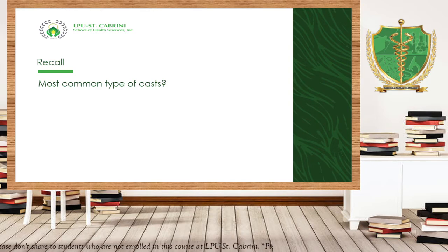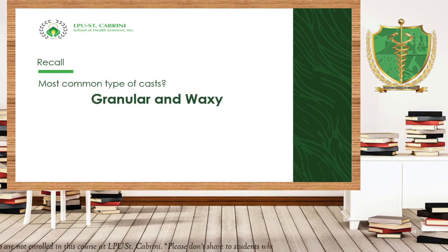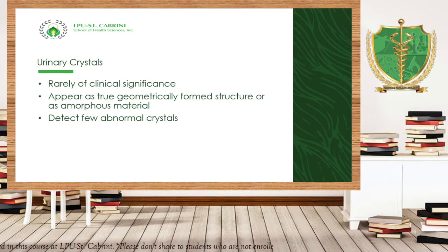Next question, most common type of cast. The answer for this one, please take note of this, is granular and waxy cast. Okay, so this time we're going to discuss urinary crystals.